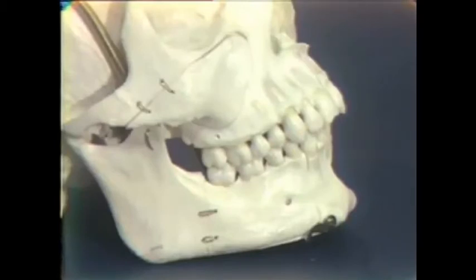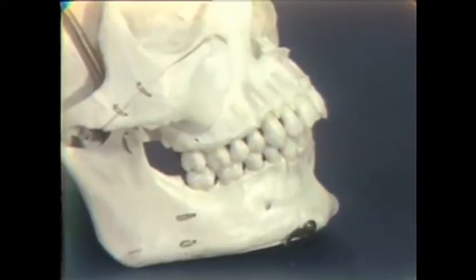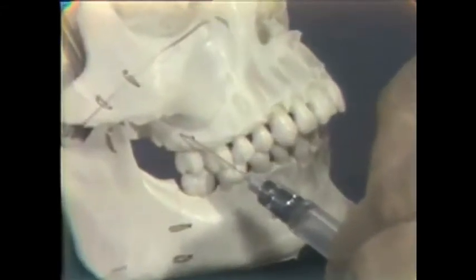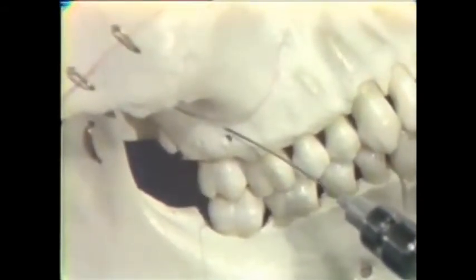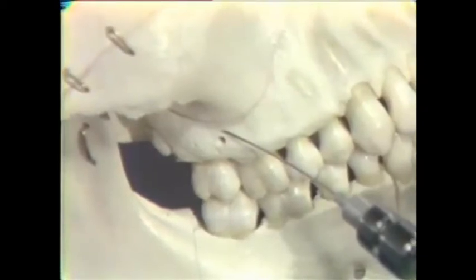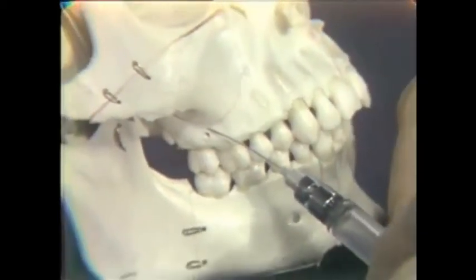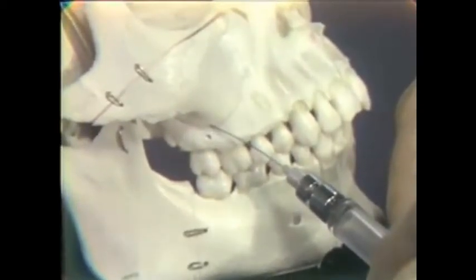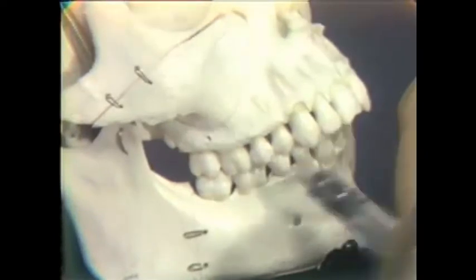With the mouth half closed, again, we retract the cheek to create tension in the vestibule, and the needle puncture is made out in the vestibule, and needle bevel then carried to bone, with at least the apex at a level of, or preferably slightly above, the apices of the roots of the first molar. Injection slowly after aspiration of approximately 2 cc's of solution, or those of you that are using carpule syringes, your maximum dosage for each injection is 1.8 cc's, but that should be adequate, and then out quickly.